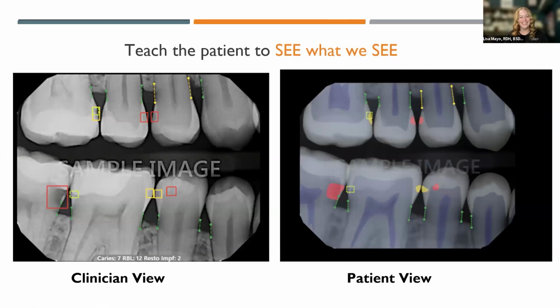Yeah, exactly. So how do we get patients to better understand their issues, address their concerns, and build trust so that they say yes to your treatment plans? Well, one very easy way is to teach them to see what you're seeing on that x-ray. It's human nature, and I'm guilty of this. People love to learn, and that includes your patient base. They want to learn and see what you're seeing so they can better understand what direction you're taking them for their treatment plans.